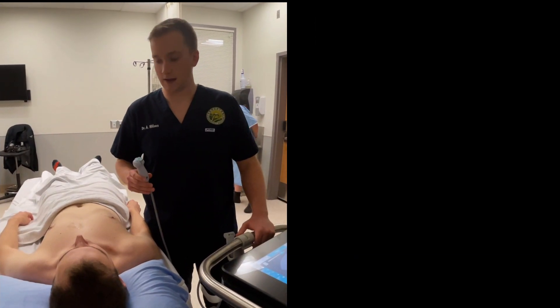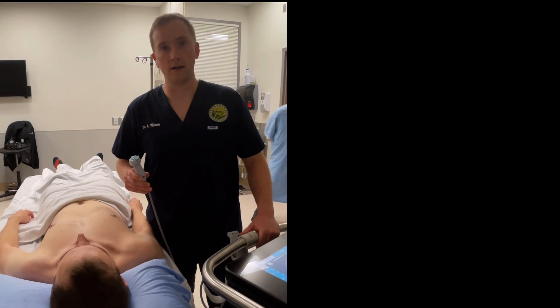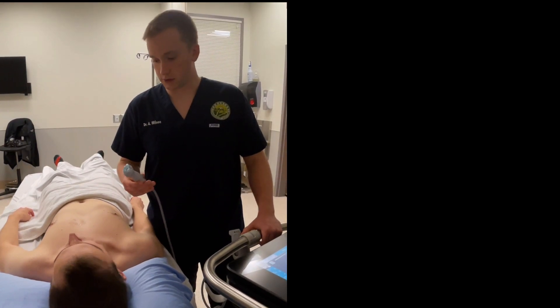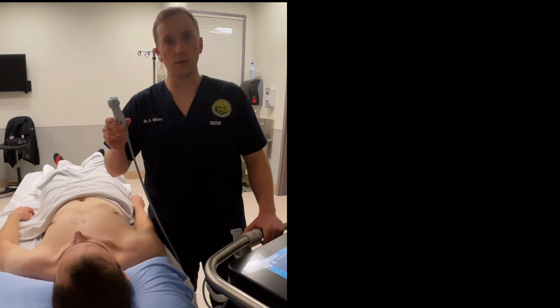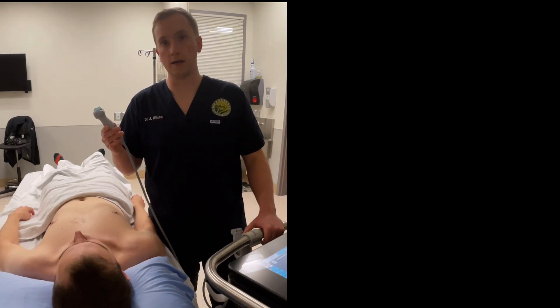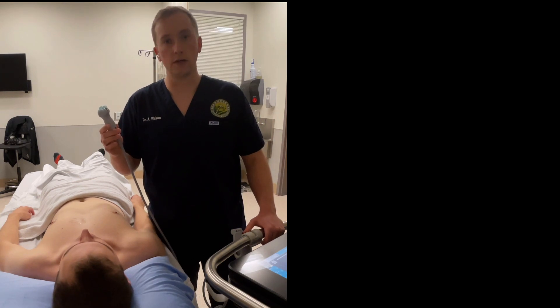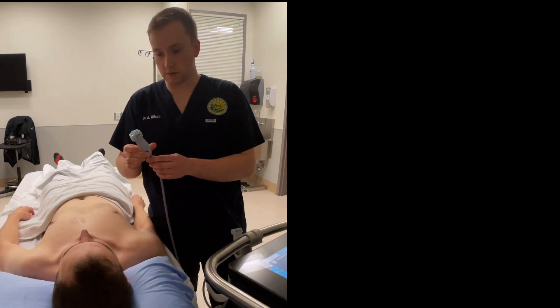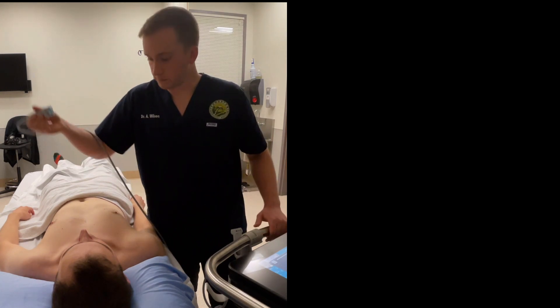Hello everyone. This is a basic tutorial on TTE image acquisition. To start, we're going to use the phased array probe. This is our preferred probe for cardiac imaging because it has a small footprint and allows you to look between ribs relatively easily. It also provides a relatively high resolution of the heart.